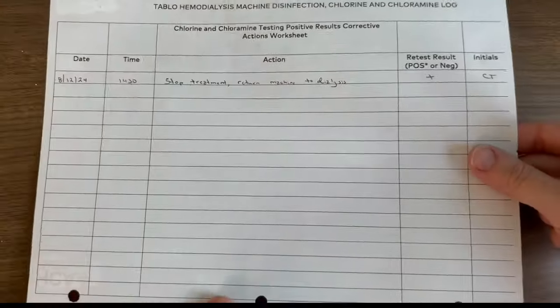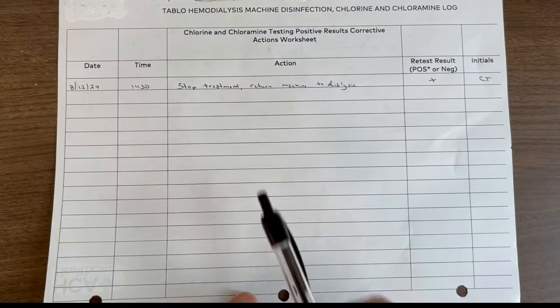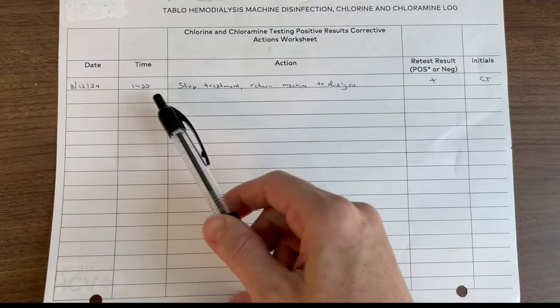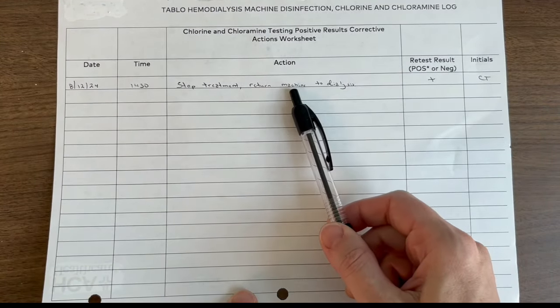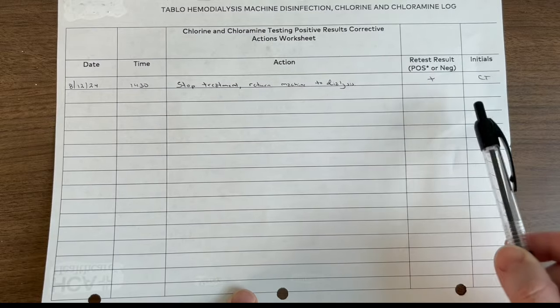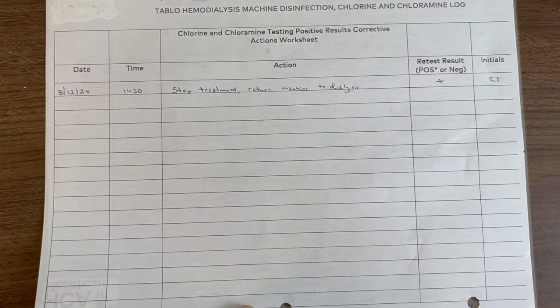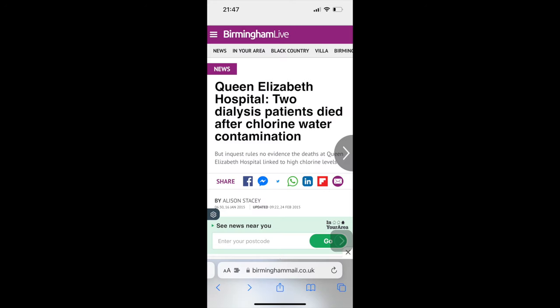If you ever get a positive, mark on the back of the paper the date, time, the actions you took, and the results — positive or negative — and return the machine to dialysis immediately. There have been patients who have died due to dialysis treatments where the chlorine was too high, so please pay close attention to this step.